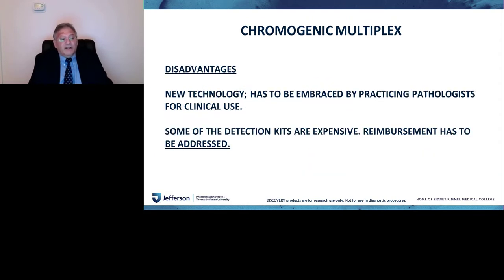Okay, the disadvantages. The major disadvantage here is that this is a new technology and has to be embraced by the practicing pathologists. When I showed these images to colleagues, some of them complained that too many colors are too confusing. So this is something that we have to accept.